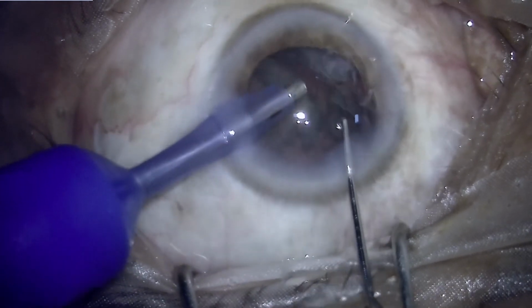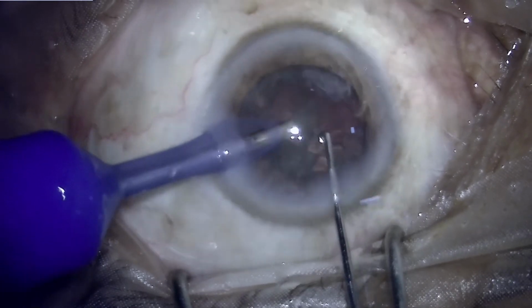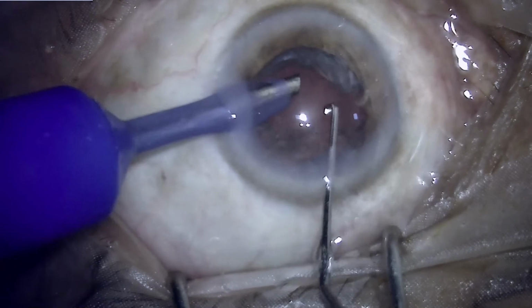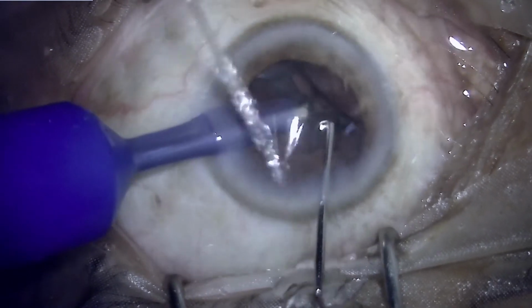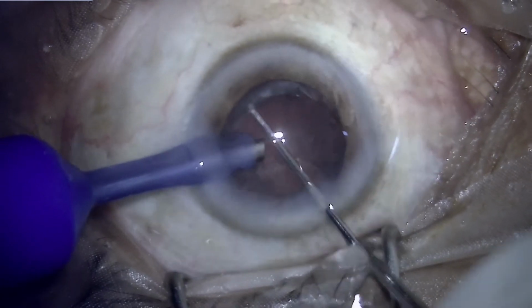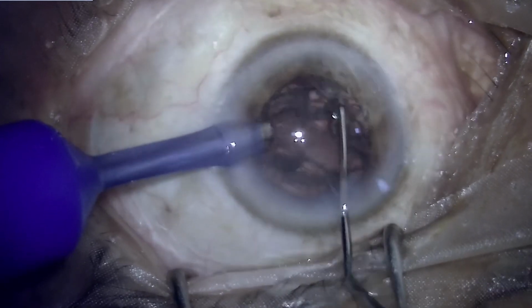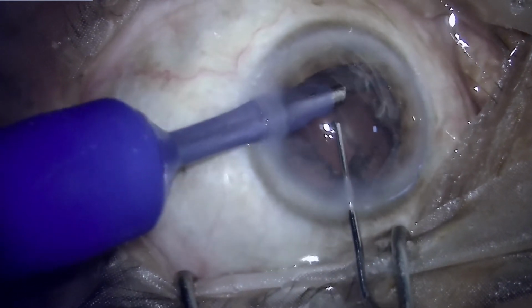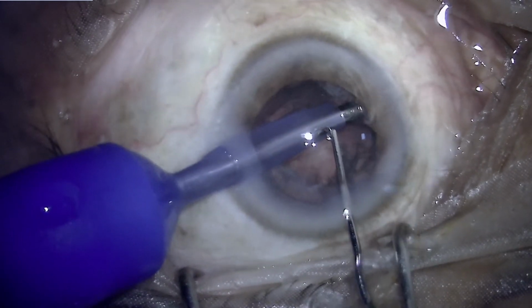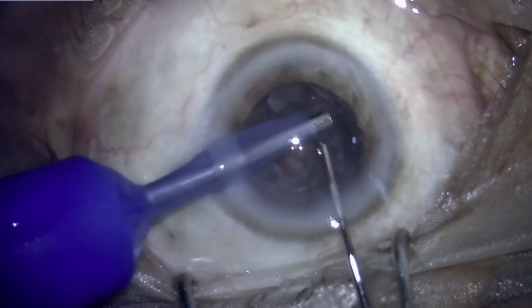so just the aspiration can be used to get a good grip over the nuclear plate which has been left behind, and then this plate can be dislodged from the bag, and once it is dislodged it can be consumed. So the strategy has worked, and now we have the epinucleus and some amount of nucleus left behind, which is now amenable for management, because once the bag is partially empty, it is easier to manipulate the pieces which are remaining back and safely remove them.